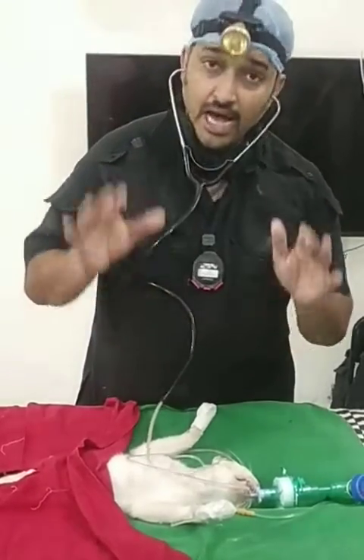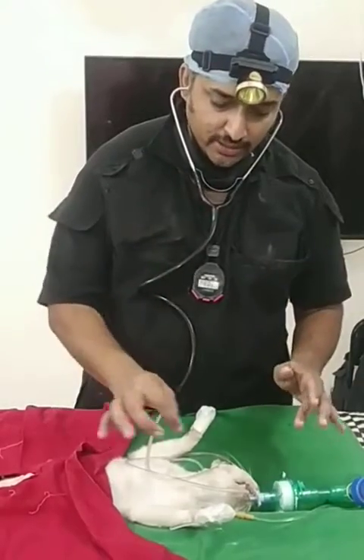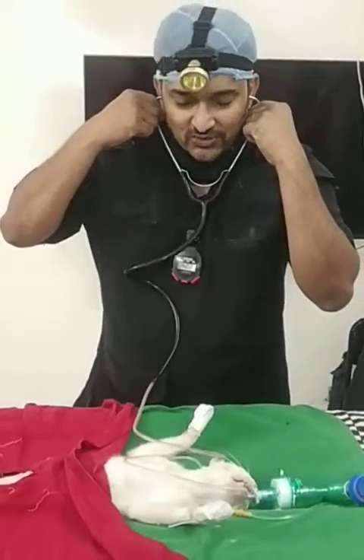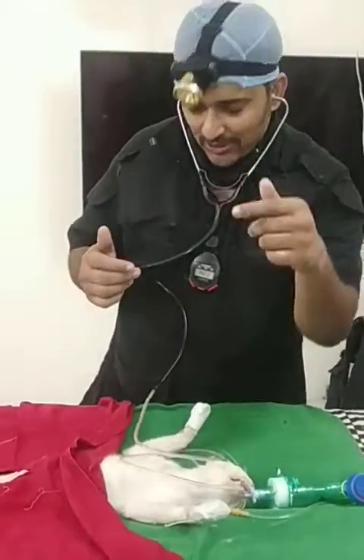The vocal folds are sensitive, so I made sure the patient was intubated and had a secure airway, so the chances of affecting anything are literally nil. I measured it, put it in, and here we have a successful esophageal stethoscope. To all my dear veterinary community across the world — thank you so much.